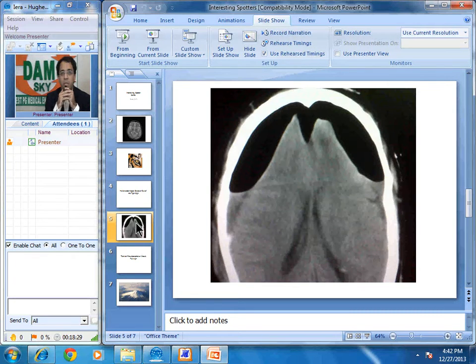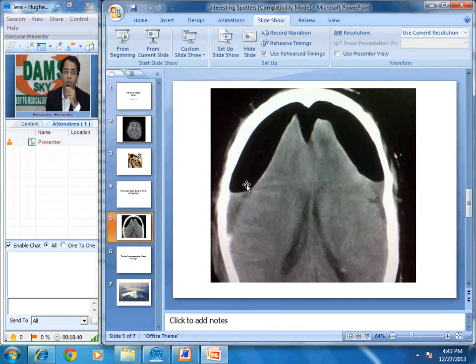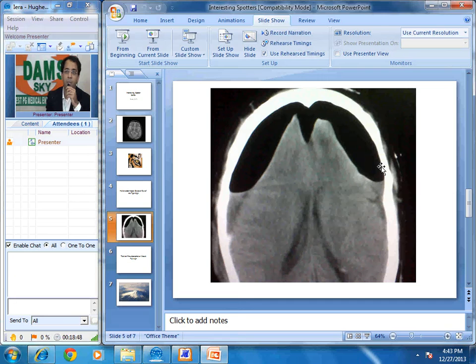Now let us look at the next sign. This is a post-surgical patient and this is the CT scan image presented to us during early morning rounds. We can identify this is brain, and there is air collection in the cranium — this is called pneumocephalus.